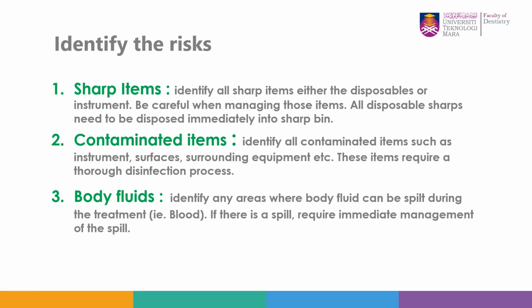Right, so let's look at the risk. Just imagine after you finish the dental treatment for your patient, you will end up with a lot of dirty instruments that you have used. There are a lot of disposable items, especially gauze, needles, and others.